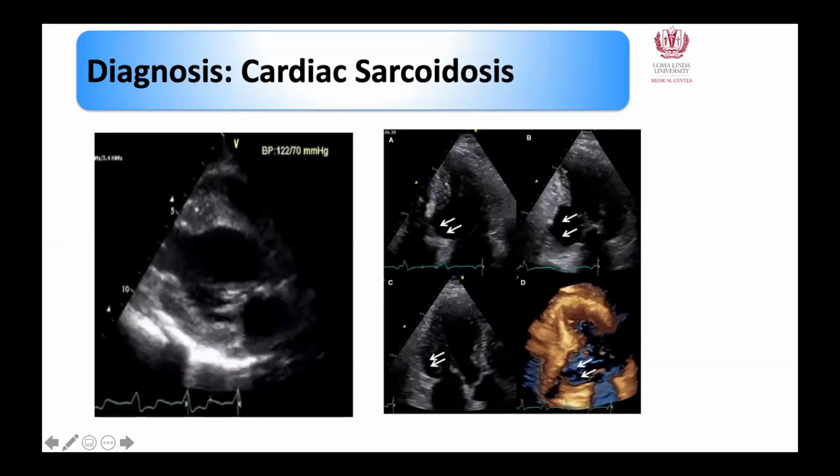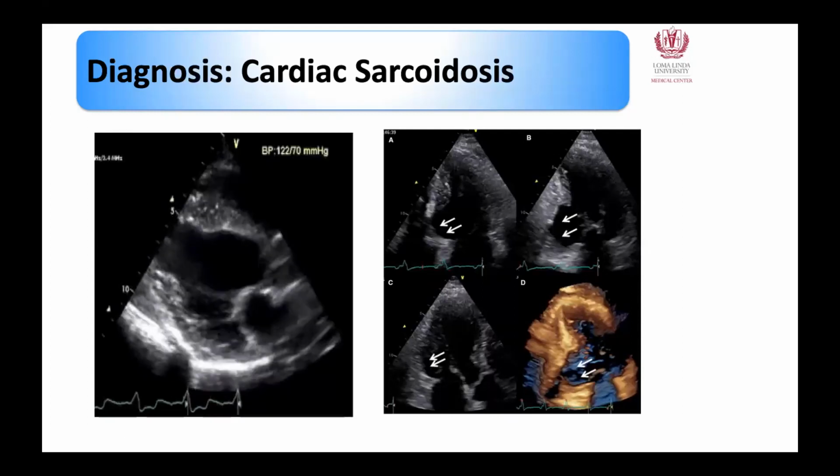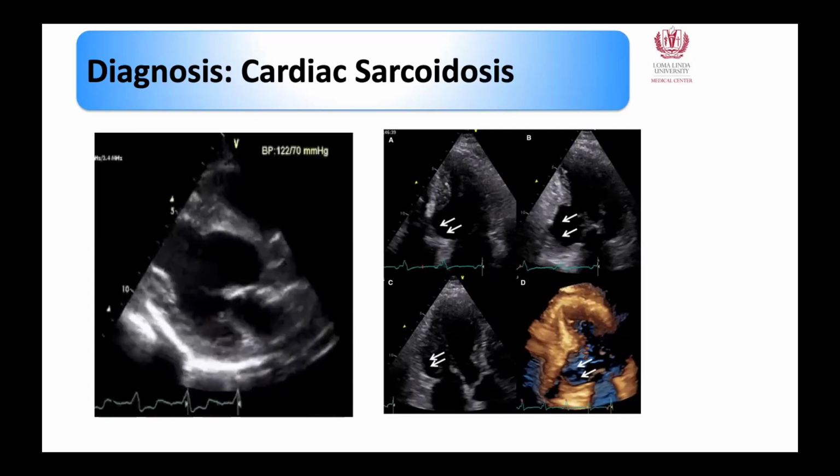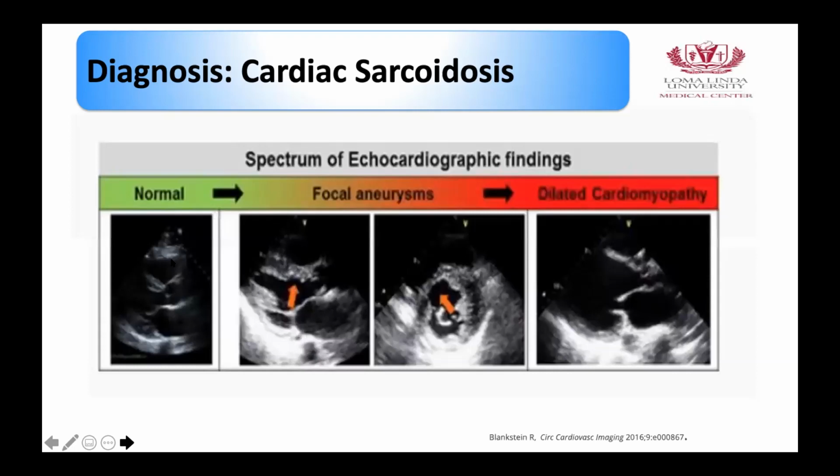Sometimes when you're scanning on echo, you really need to bring these abnormalities up. Depending on the cut of the echo, you may not be able to see it. So let's go to the stages.